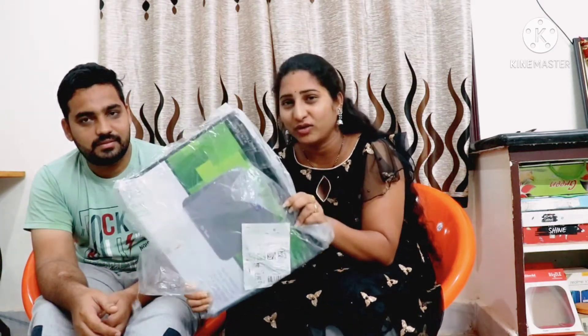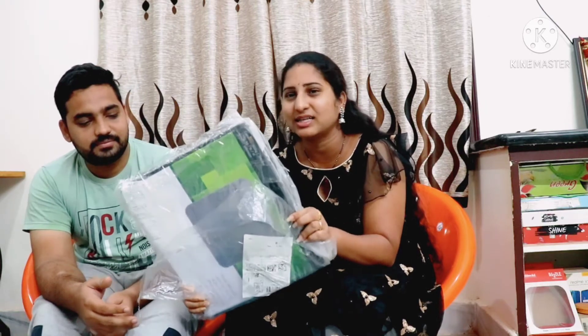Now we are going to review the price. We are going to check the weight. We will review the most recent issue. Let's take a look.